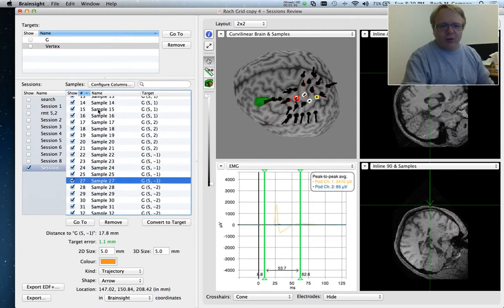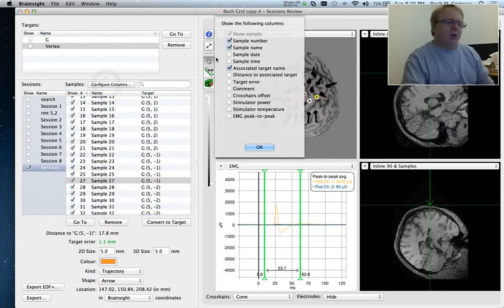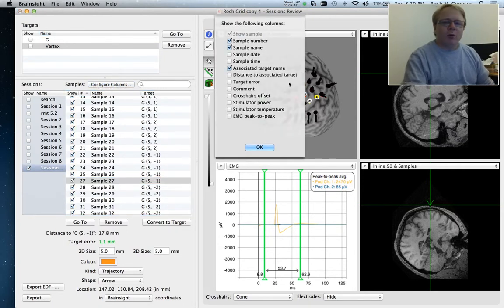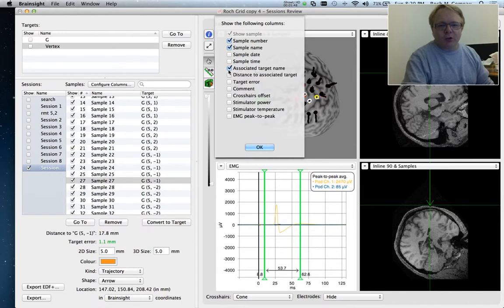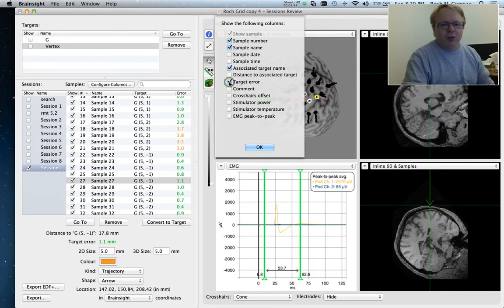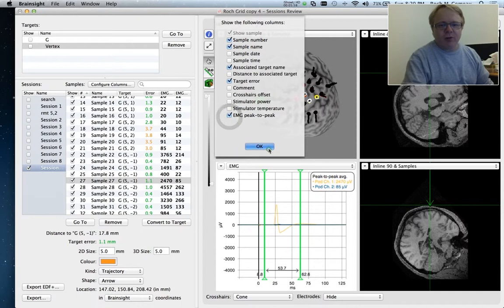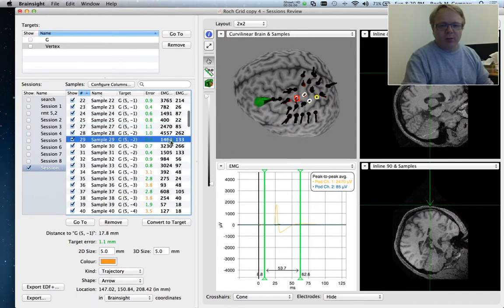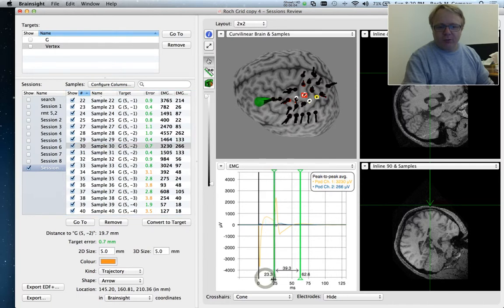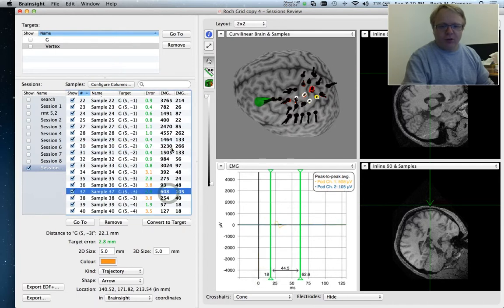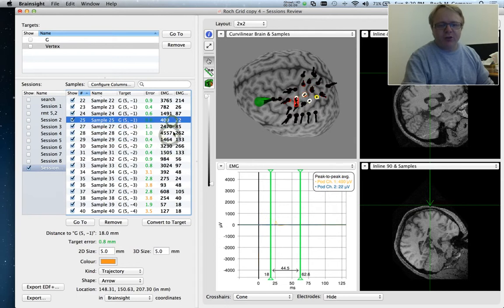So if you look at this area here, we can click on configure columns and decide what we want to see in this little list. So the sample numbers, sample name, of course, the date, the time, the associated target. So we know where we were. We also know where we meant to be. So we know the error. We know how far off we were. I can also have the peak to peaks of the MEP values themselves. Now I can easily see what the MEP value was. And I can go looking for. There we go. So I can study this data.